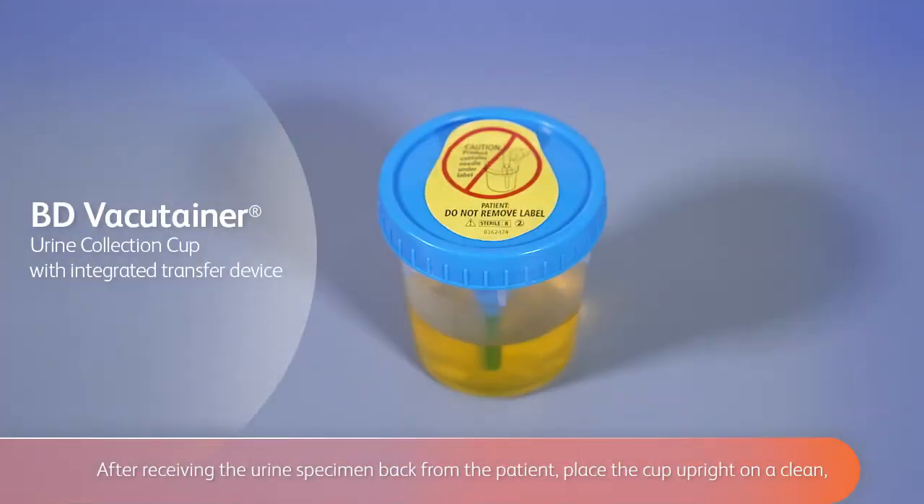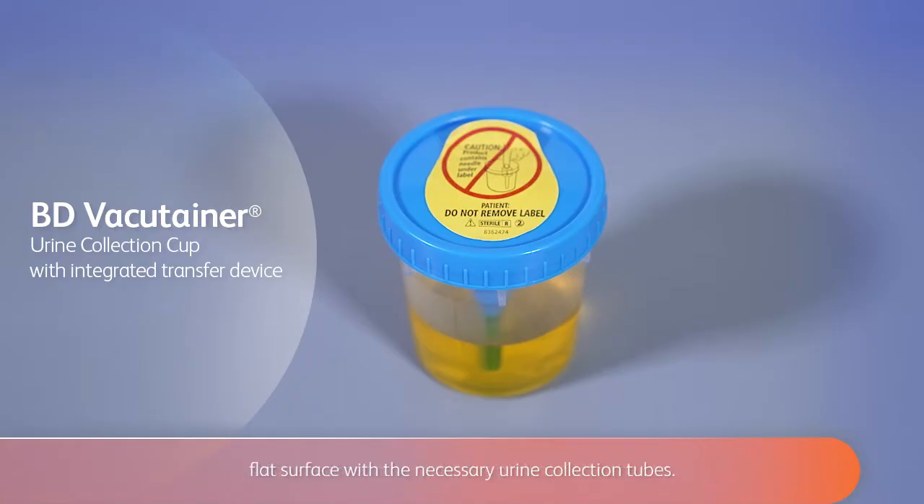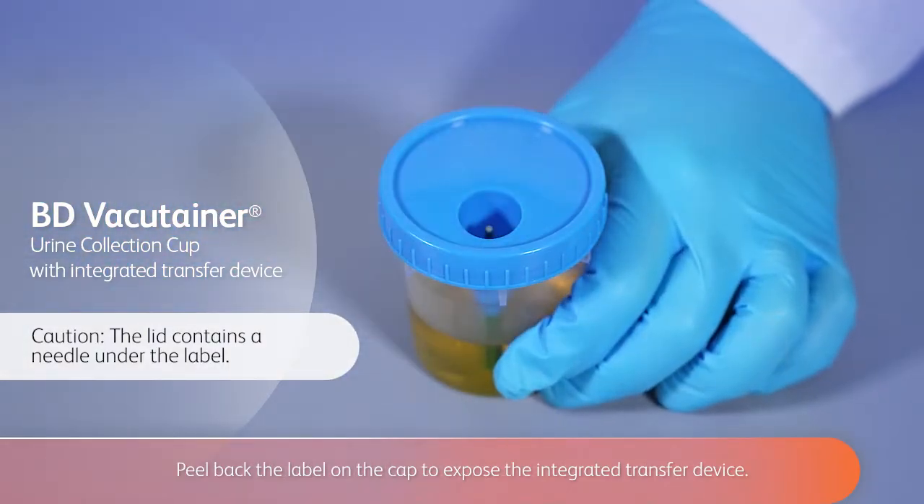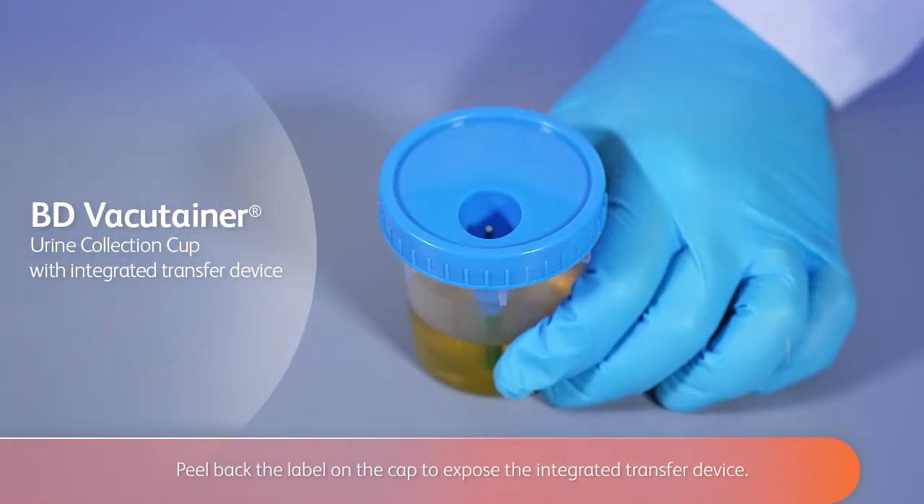After receiving the urine specimen back from the patient, place the cup upright on a clean, flat surface with the necessary urine collection tubes. Peel back the label on the cap to expose the integrated transfer device.